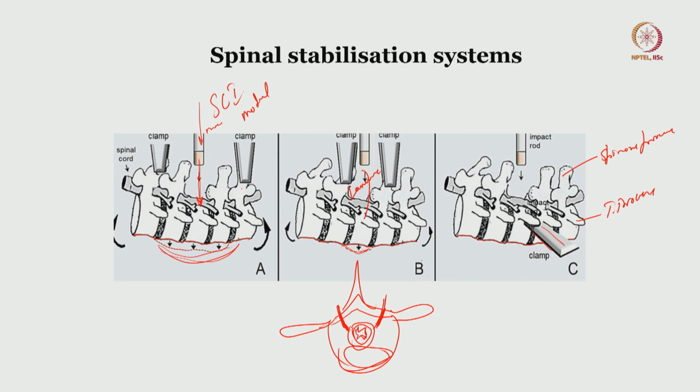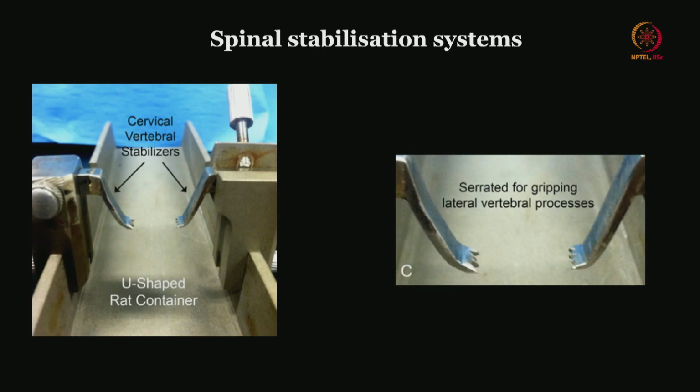Alright. So that is how the fixations are recommended, and this is the preferred way of fixating the spinal column when you are using the injury models. For that matter, any laminectomy procedure, this is the best way of fixation. So what sort of setup is used to achieve that sort of fixation under the transverse process is this.